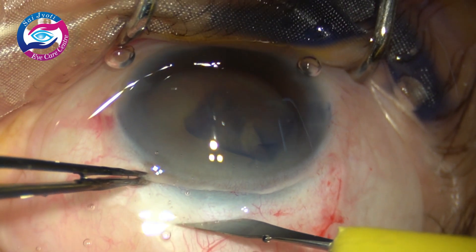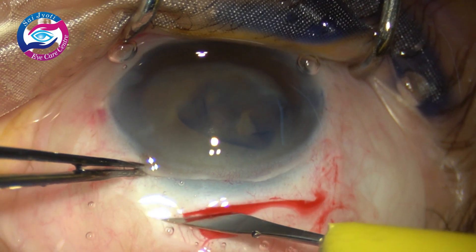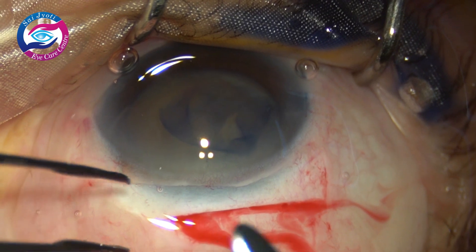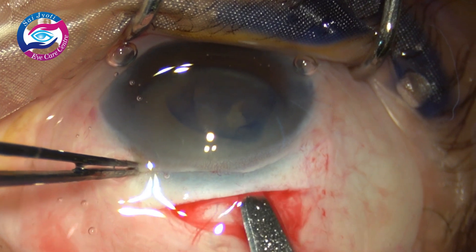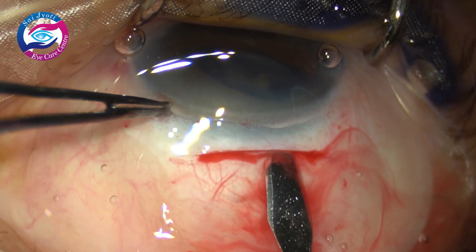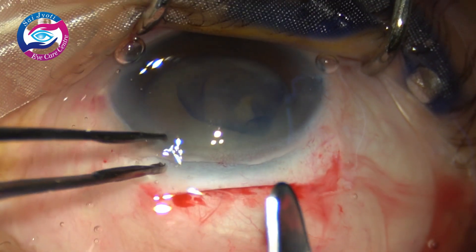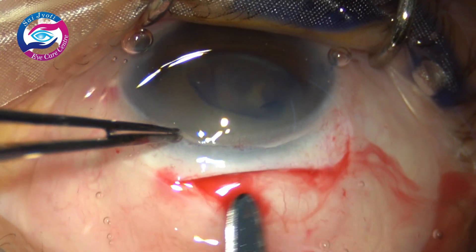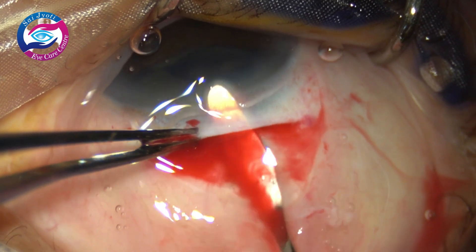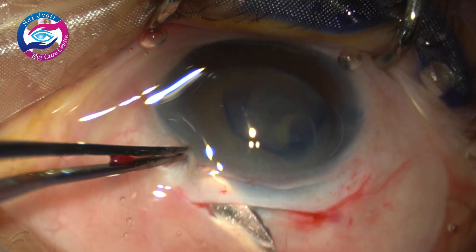I will demonstrate one more video. Another case — again a frown shape incision is made. I am purposely moving the eye downwards so that I get a better view of the site of incision. Usually cauterization is not required once you make the incision. Again with the help of a crescent I am just marking the ends of the incision. There is no need to enter the crescent hole into the wound, just slightly about a few millimeters. This is how you get to know whether you are in the correct plane of the sclera or not — because once you enter the crescent you can see it through the sclera. Then you get an idea that you are in the correct plane. We enter about 1.5 millimeters into the corneal stroma and then move sideways with slow movements.